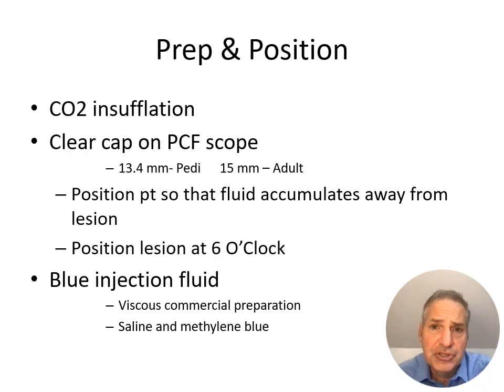To begin resection of the lesion, we want to position it in the 6 o'clock position and think about repositioning the patient if necessary so that fluid accumulates away from the lesion. We want to prepare to initiate the submucosal injection with a blue injection fluid. This can be a combination of saline and methylene blue or a commercially available, more viscous solution.